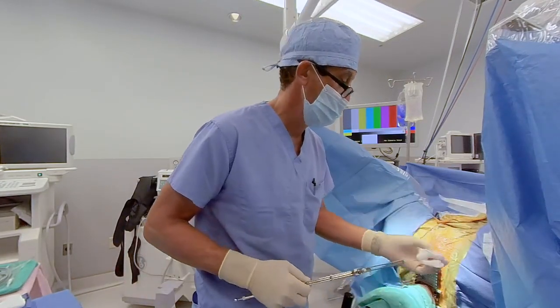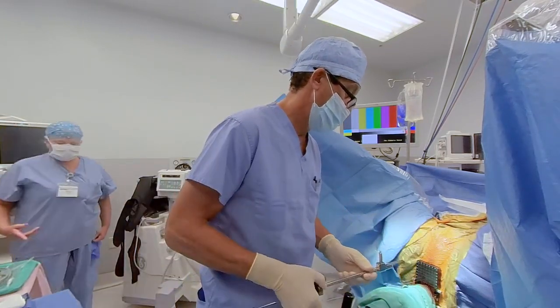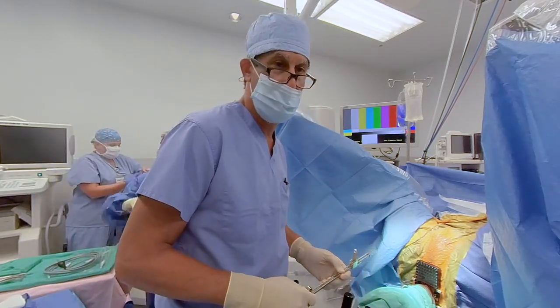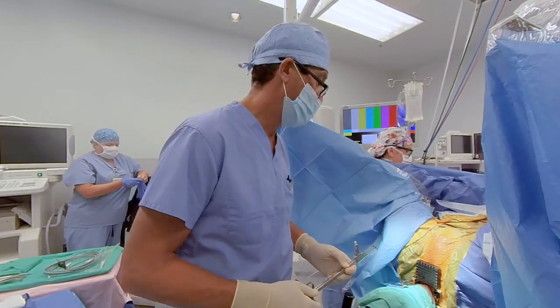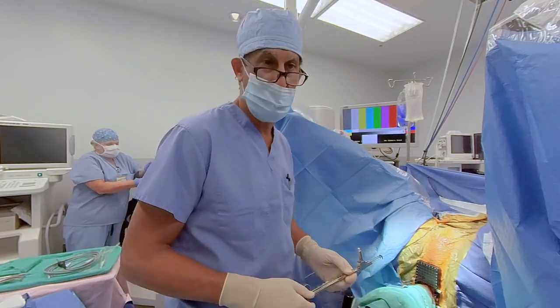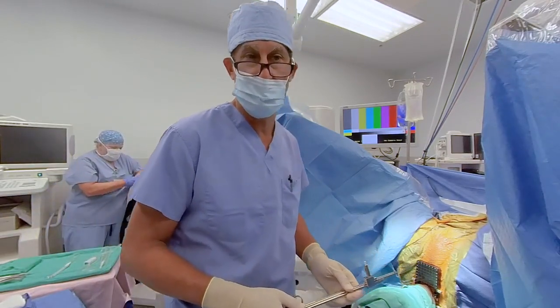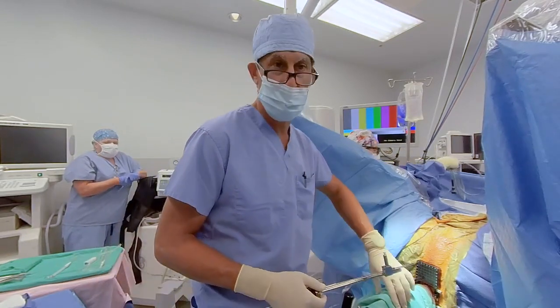Preferred needle order you'd like to go in, left to right, top to bottom? It varies. Sometimes it's based on visibility. Sometimes I go from left to right, top row, next row, following row. There are times where I'll do central needles first. That removes some of the artifact, and it makes the peripheral loading a little bit easier to visualize. So it just depends on the prostate, the visualization and the needle placement, but no particular order.